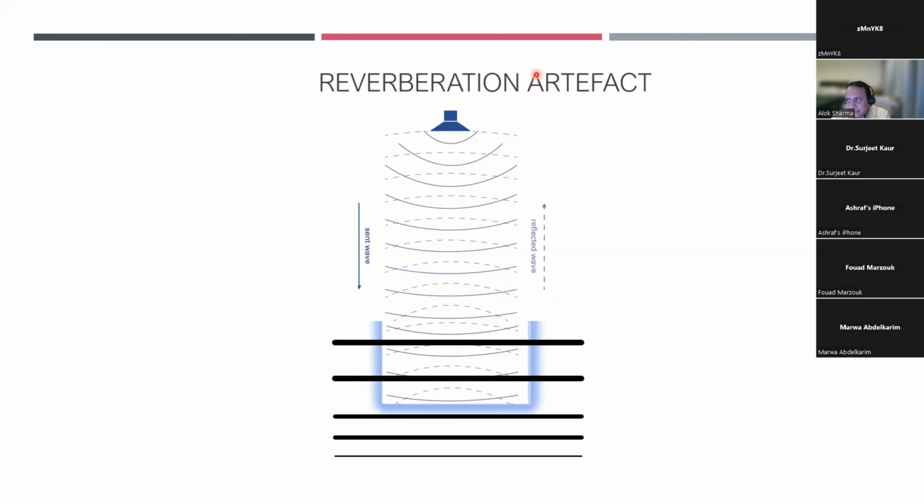Okay, we have a question. Yeah, go for it. Which zone of the lung are these A lines being created? Okay. Okay, let's just change our probe very quickly.